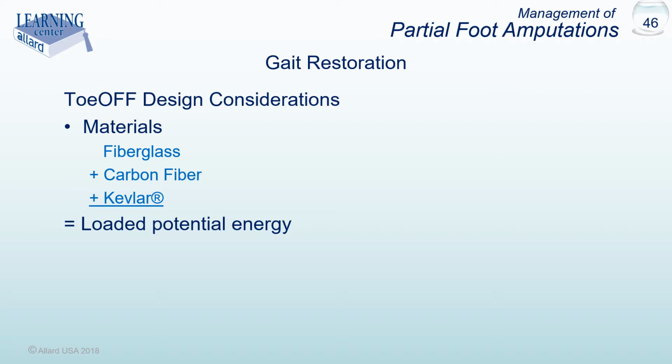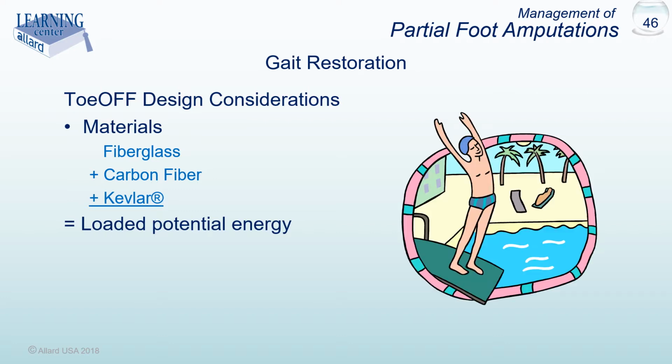The concept for these devices simply mimics the function of a swimming pool diving board. Once a person loads potential energy into the board by jumping on it, the board has no choice but to spring back or return that kinetic energy.